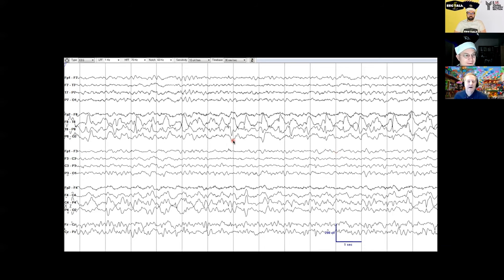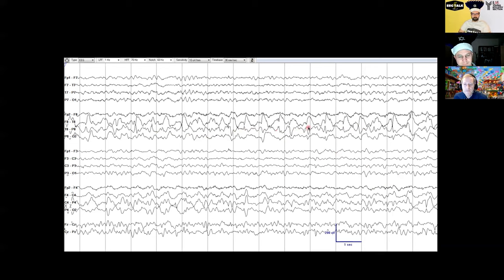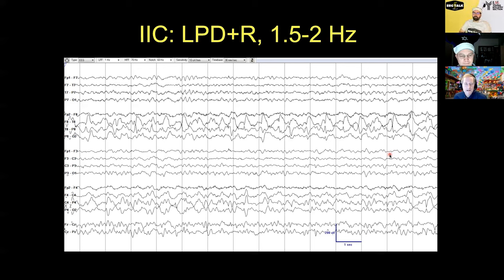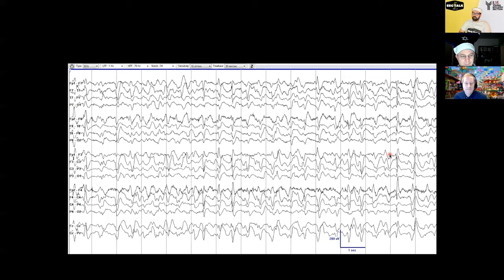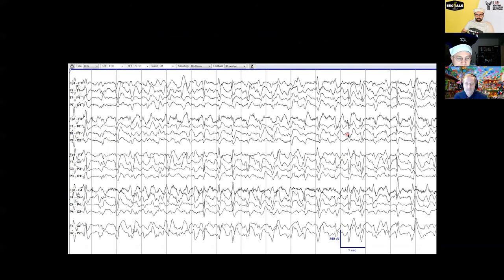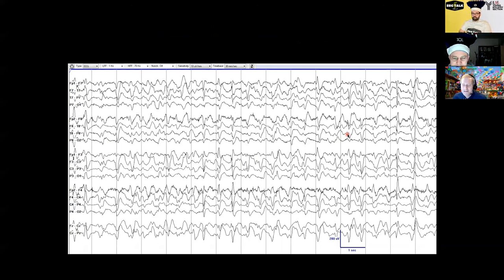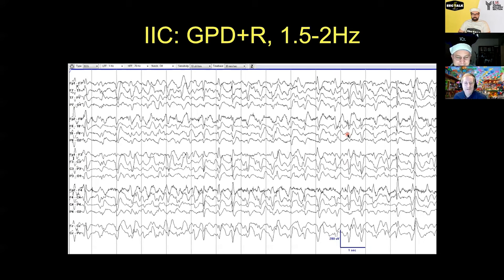Here's a pattern — a combination of periodic discharges and rhythmic delta, not super regular, but something rhythmic going on at a little less than 2 hertz, pretty much 1.5. This is a nice example of the ictal-interictal continuum in one hemisphere on the right side: LPD plus R at 1.5 to 2 hertz, lasting more than 10 seconds — that's on the IIC. This is a generalized example, very similar but now it's everywhere, about 1.5 hertz, maybe slightly faster, plus rhythmic. Higher amplitude — you might be more interested in treating this one and thinking it might be causing clinical impairment, but it's still IIC and still not fast enough to call it a definite electrographic seizure.